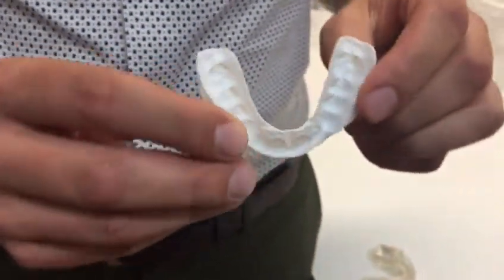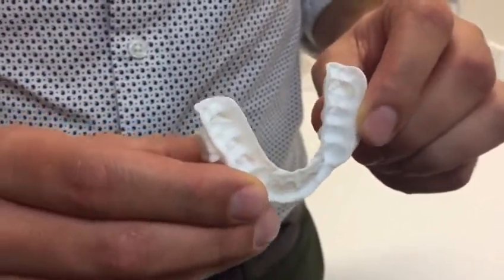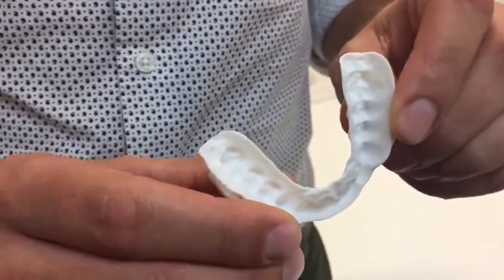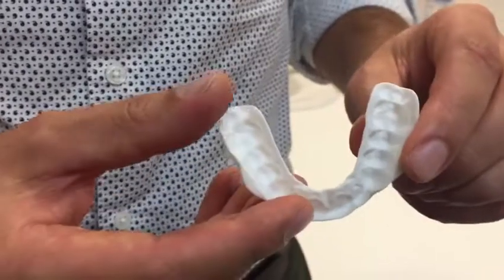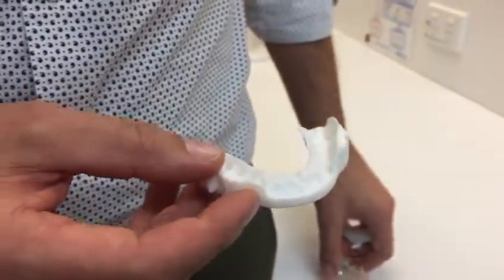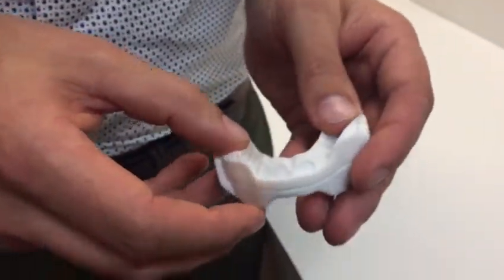The new appliance is much thinner, and we've had lots of good feedback from patients telling us that it feels much more comfortable than their previous versions. We're much more confident in how long this can last, and we've increased the warranty on the appliance from one year with the older style to two to three years with this newer nylon-based style.